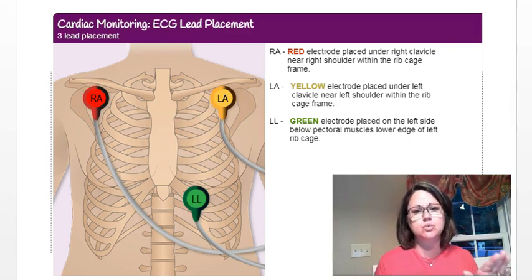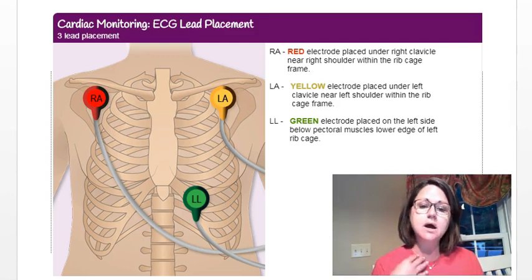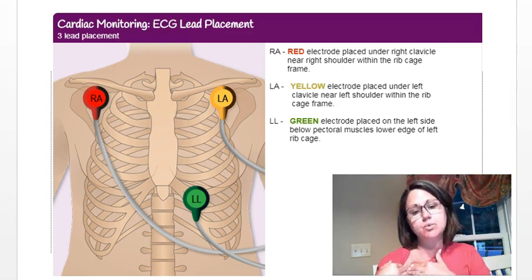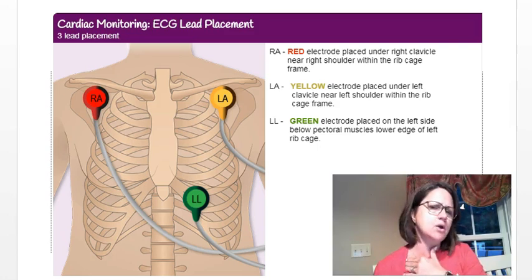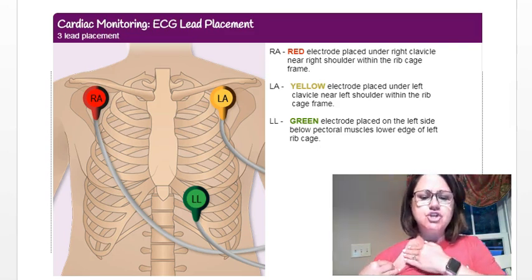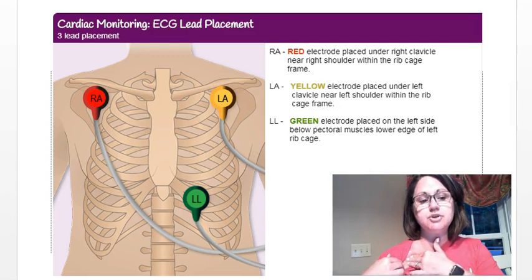Maybe yours says RL for right leg, but you're not actually going to put it on your leg — it's more of a directional term. Your red lead, or the one marked RA, should be placed right under your right clavicle, near your right shoulder but within the rib cage frame. You want to avoid bony prominences — don't put it on your collarbone. Palpate your chest and place it not on the rib but in between.